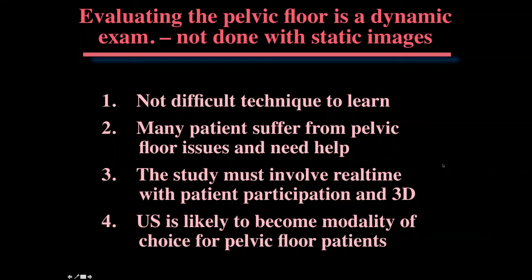Now here's another question. Could you describe what settings you use while looking at the pelvic floor 3D, 4D threshold? You use a specific size region of interest box looking at the pelvic floor. I just put the probe back there and just push the button. I mean, it's that easy. I don't use any particular setting. Just like you would if you're using 3D to look at the uterus.